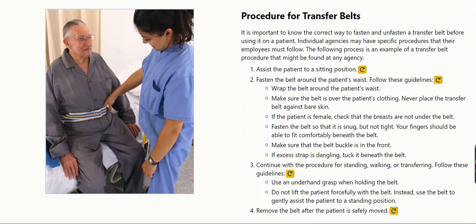Wrap the belt around the patient's waist. Make sure the belt is over the patient's clothing. Never place the transfer belt against bare skin. If the patient is female, check that the breasts are not under the belt.